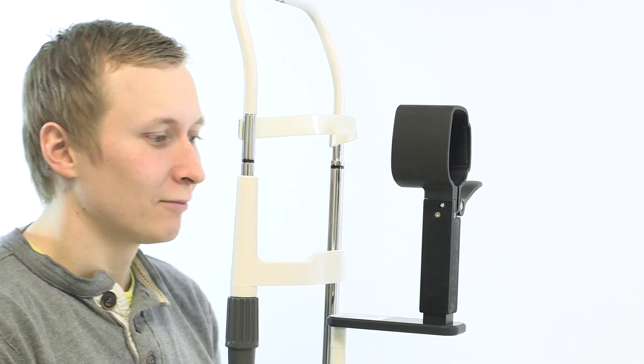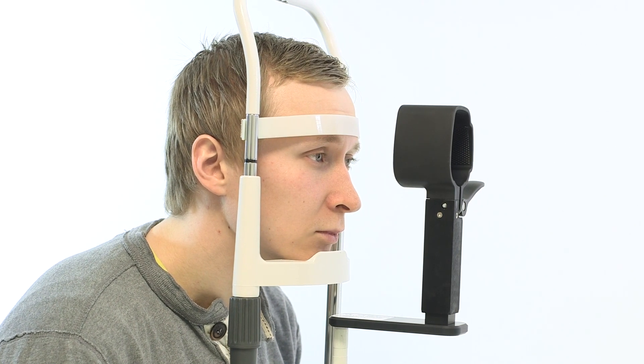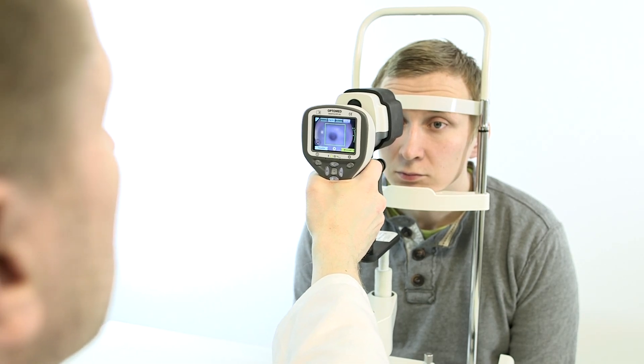The patient is then asked to rest the chin and forehead against the camera's supports so that the head remains still throughout the examination. The doctor then continues to take pictures as the fluorescein moves through the blood vessels into the retina.